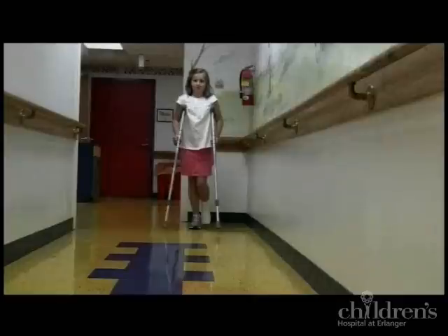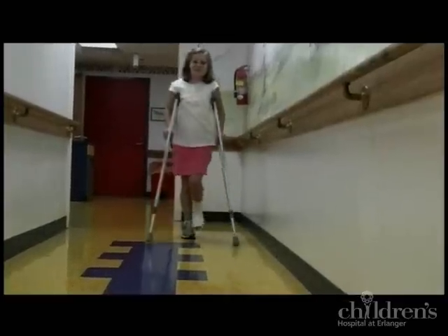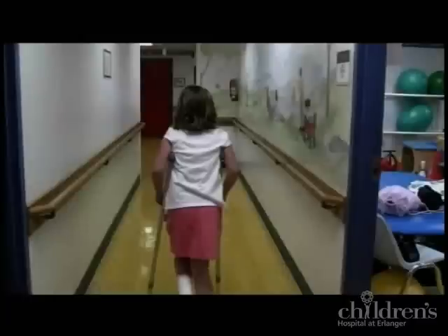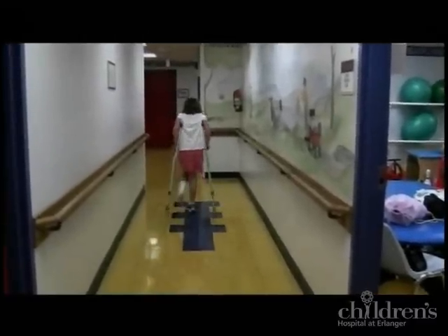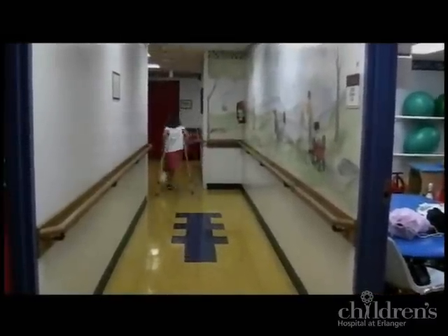Have your child move both crutches six to eight inches in front of them at the same time, and then advance the non-injured foot past the crutches. Make sure your child does not swing the injured foot too far out in front of them, as this can cause a fall.